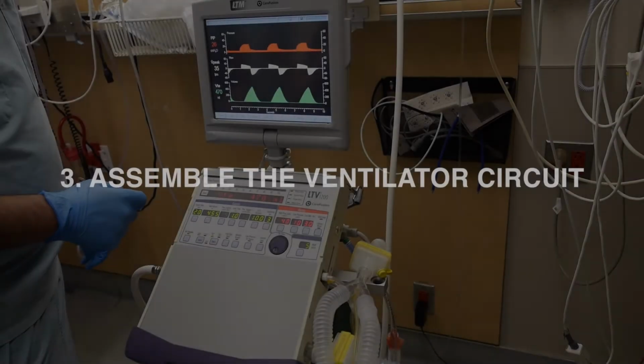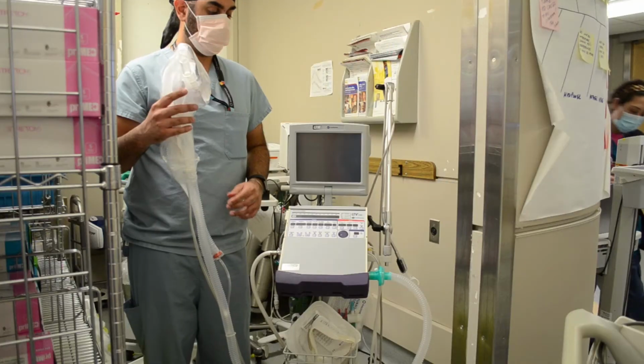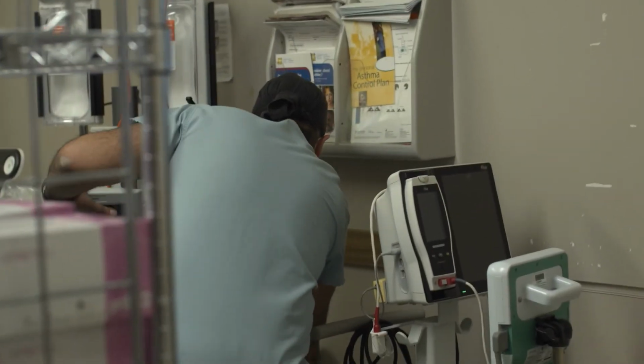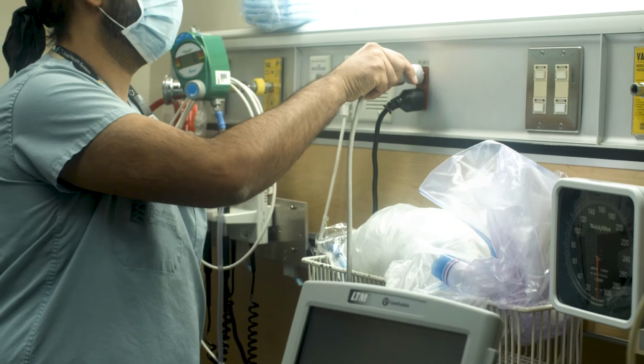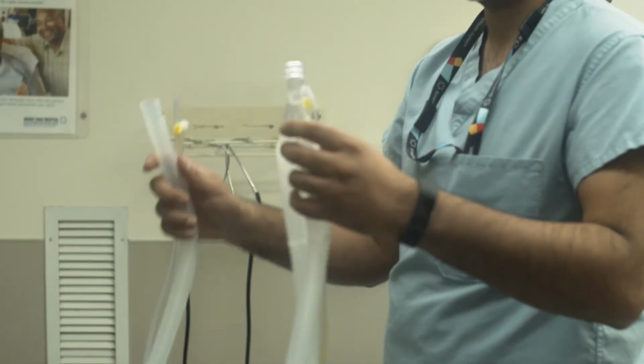Now let's get to the ventilator. The model we have at Mount Sinai is the LTV-1200 and is stored in our supply area opposite the main desk. It just needs to be unplugged and wheeled back to the patient. The first thing you have to do is plug the ventilator back in. It has a battery that lasts 4 hours, but don't rely on it. Next, you will have to circuit the system.